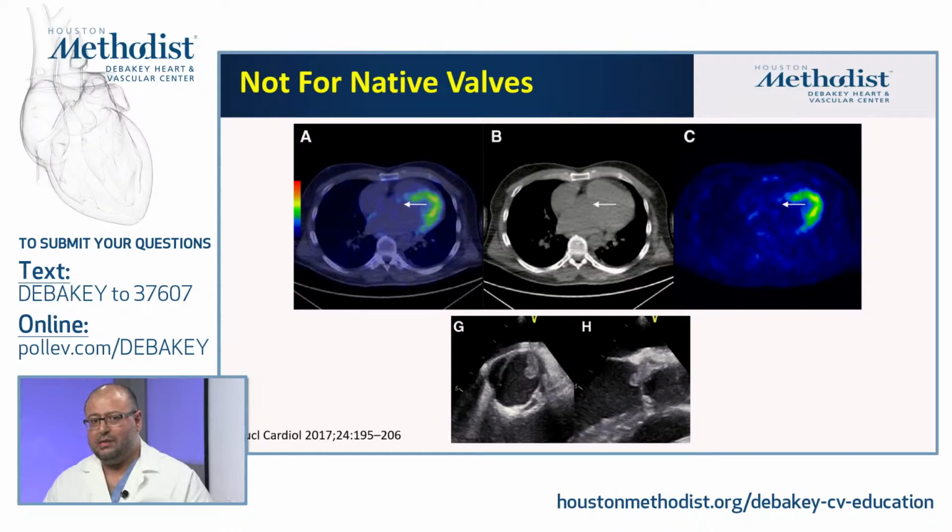So this is also a very important point to keep in mind. PET-CT does not have high sensitivity. So someone could argue that if I do it and it is negative, it doesn't help me. If it is positive and it is well prepared, then it might be helpful. It depends. You have to sort it out based on the clinical suspicion and what exactly you're looking for. And this is mostly for vegetation.